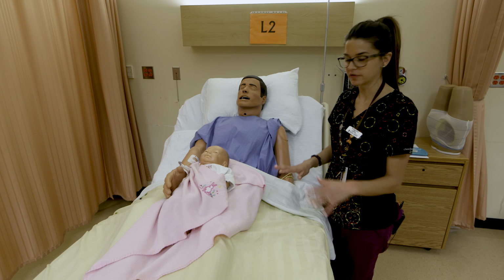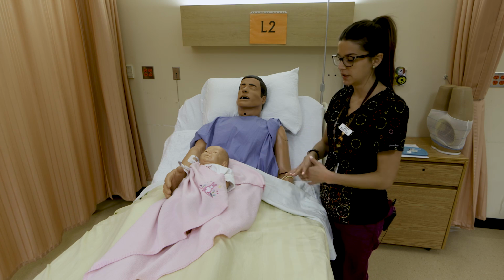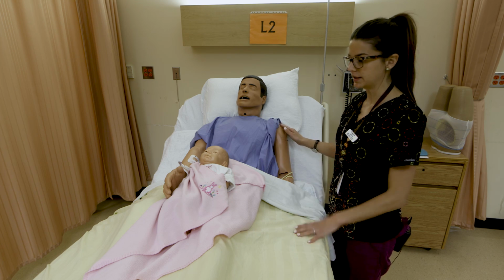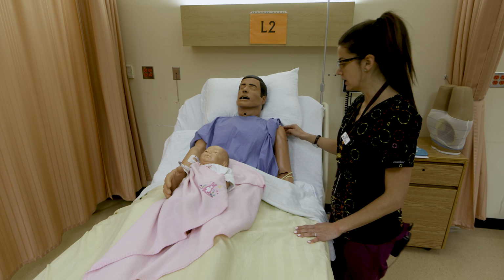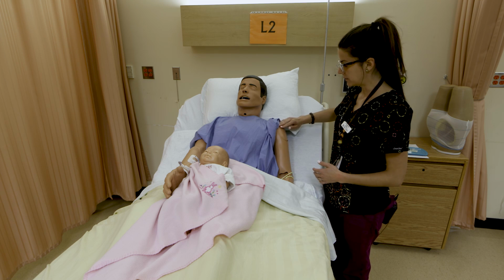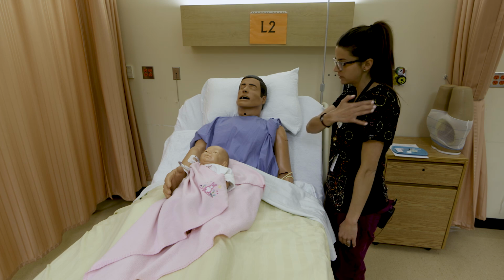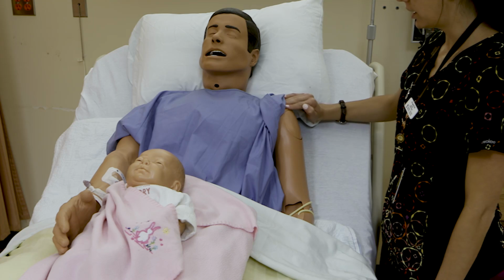We'll just go over first the different sites where you can do an IM injection on an adult, and the most common one for an infant, and landmarking. You've probably, hopefully, had IM injections or vaccinations done in your deltoid, so that's one I think a lot of people know right away. For landmarking at the deltoid muscle, you'll want to find the acromion process, and you can try to feel that out on yourself too. It's the bony prominence at the top of your shoulder point.